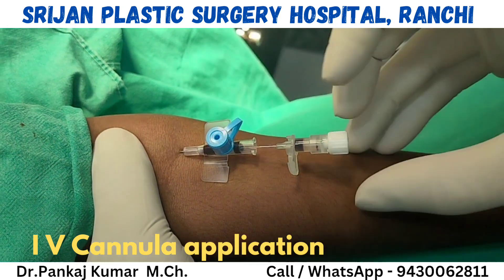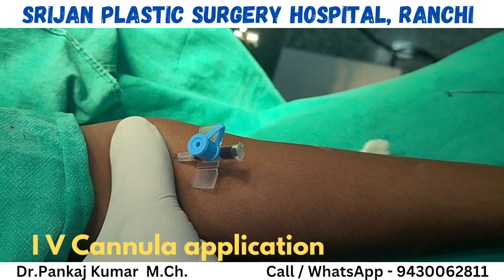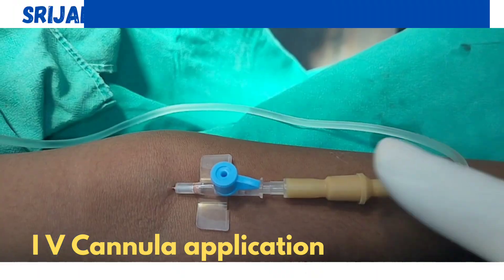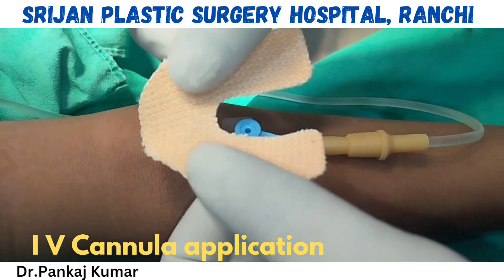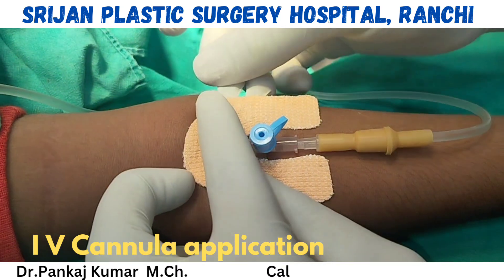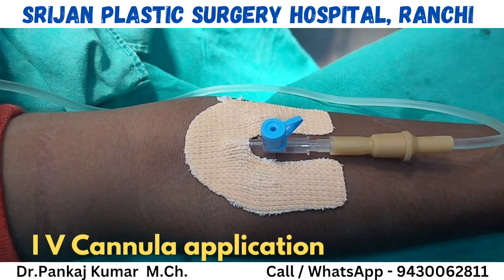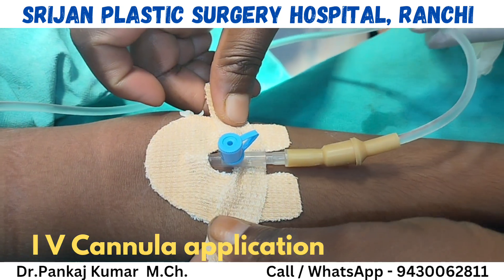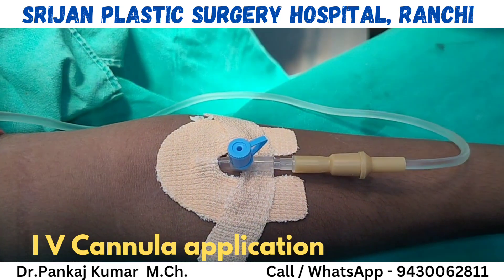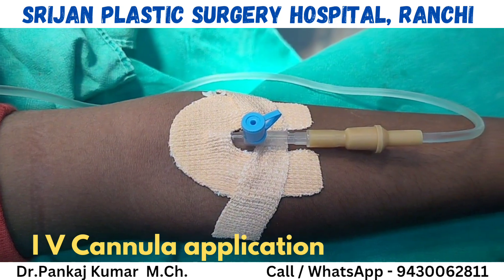Press this proximal part of the cannula so that blood doesn't come backward. Then for fixation, apply this type of sticking — these are easy-fix stickings. This is the complete step of IV cannula application.